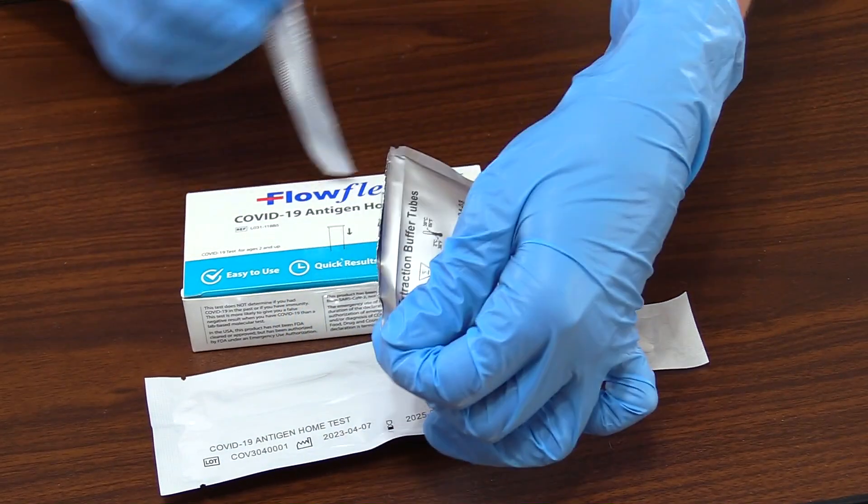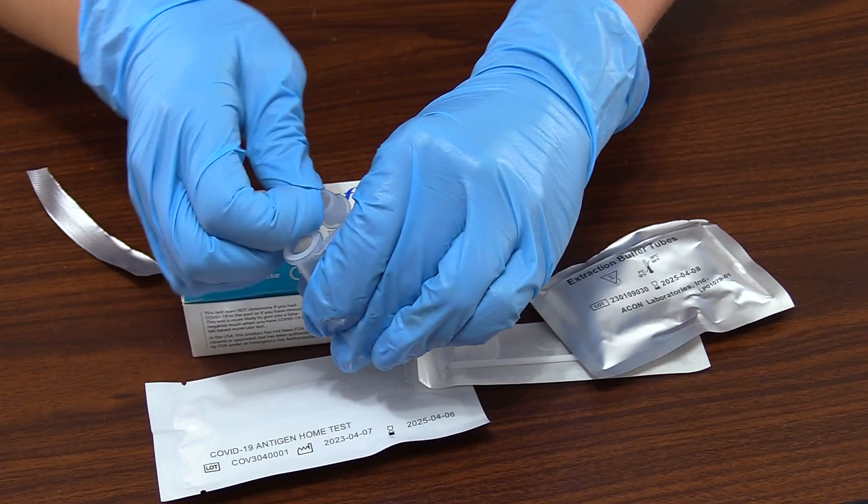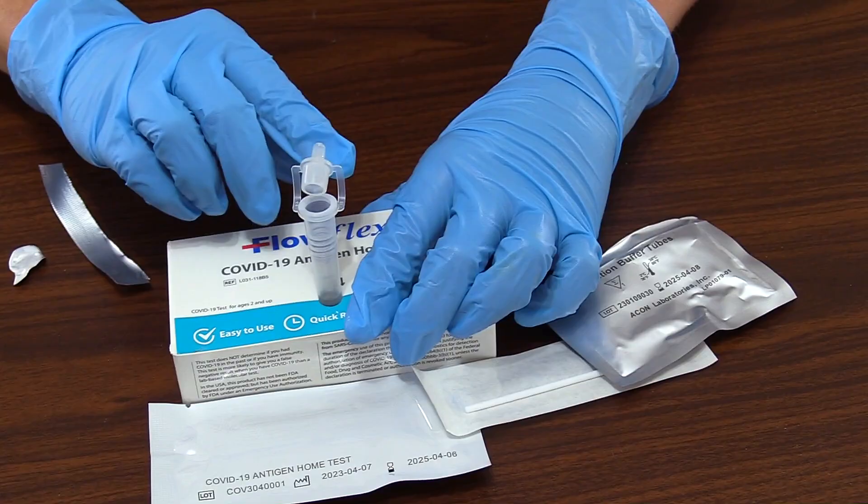Tear open the extraction buffer tube packaging and pull back the foil on the top of the tube, and then place the tube on the perforated circle that is on the box.